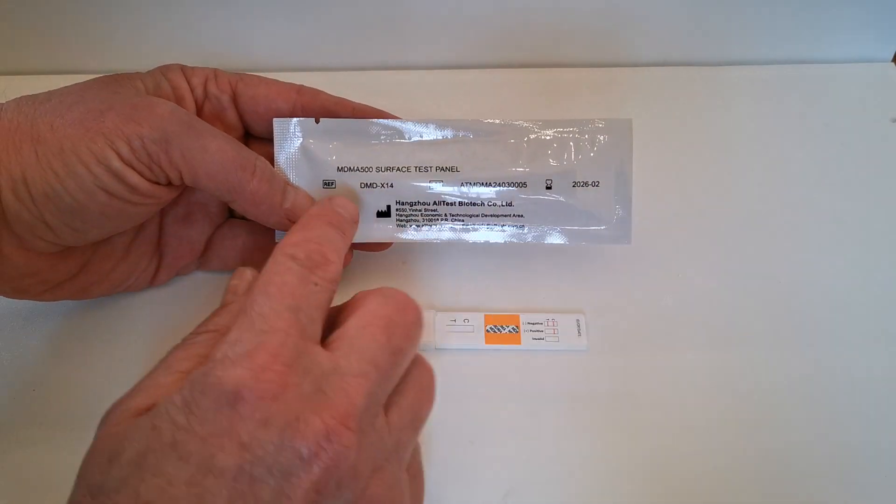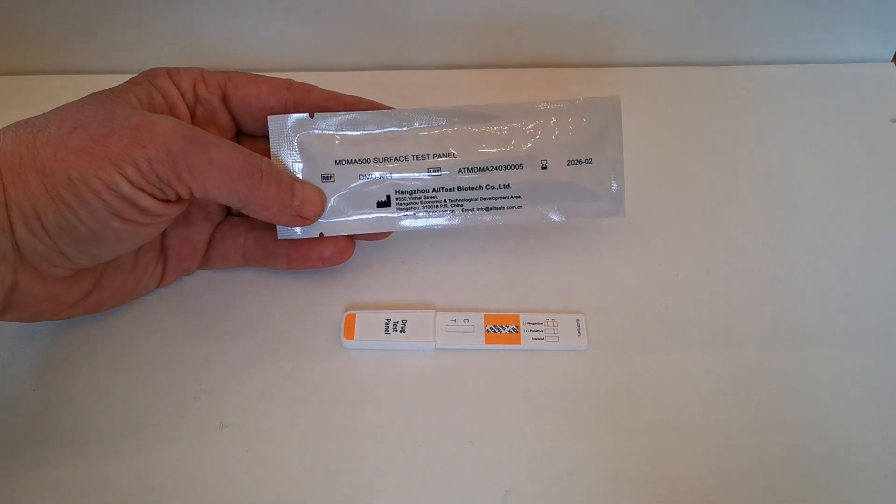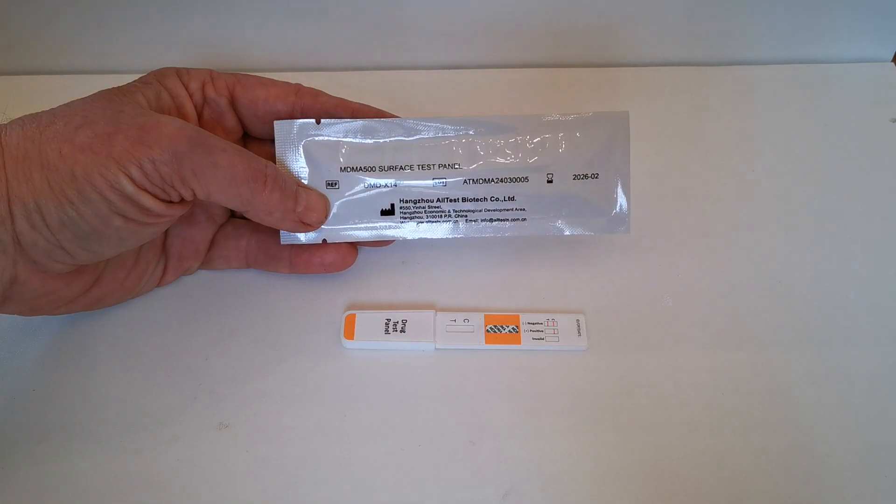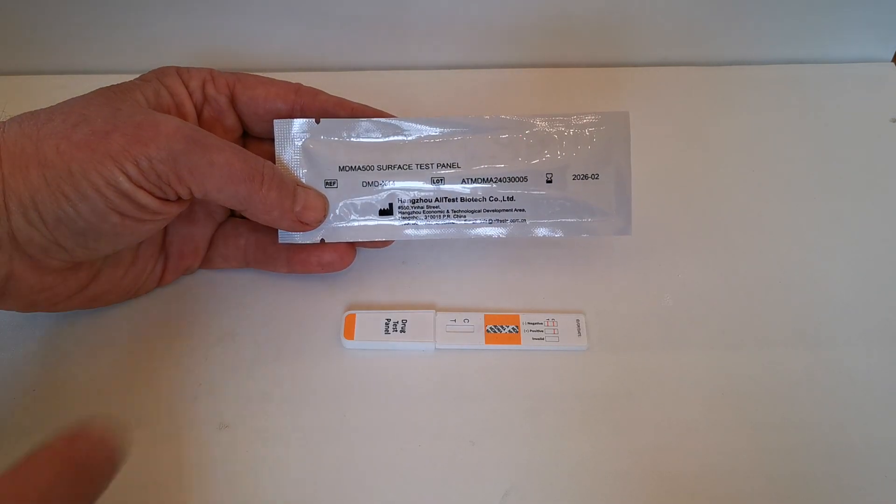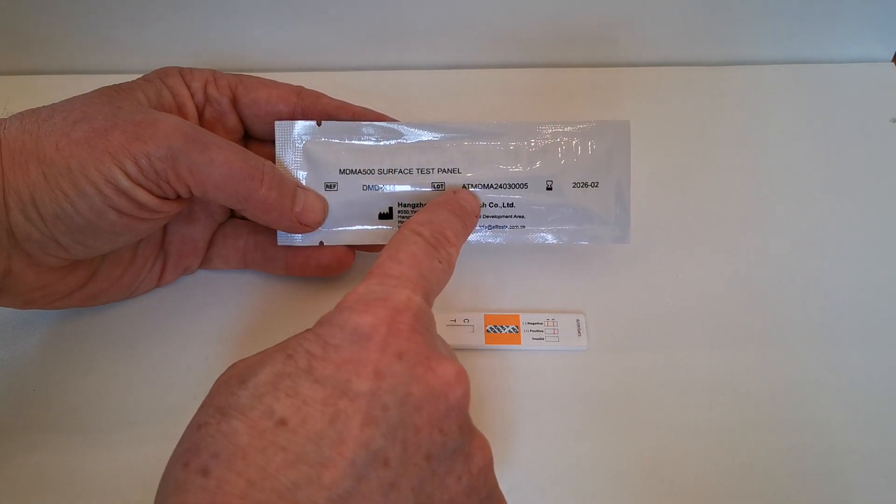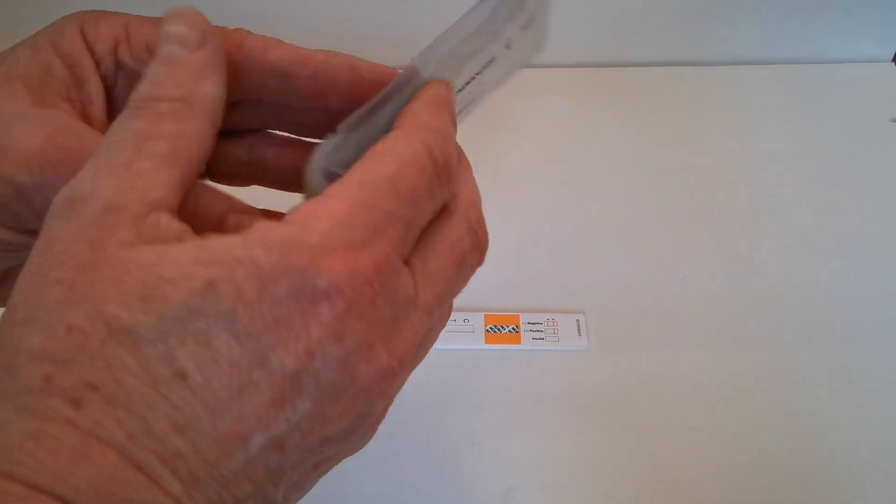On the reverse you will see MDMA 500 nanogram, which is the cutoff sensitivity surface test panel. It also has its code, the lot number, and the expiry date on the outer side of the foil.